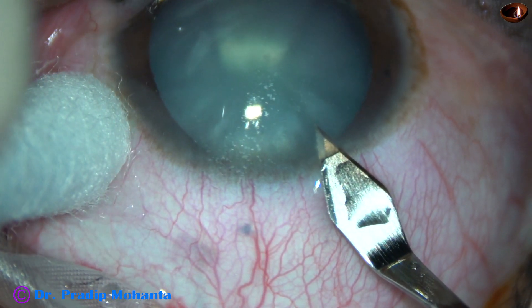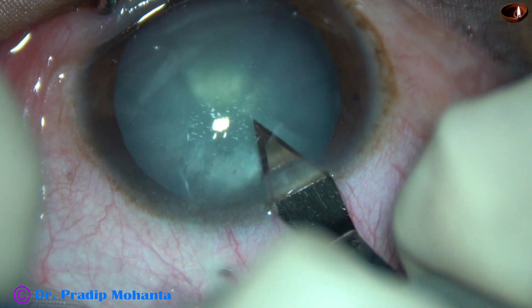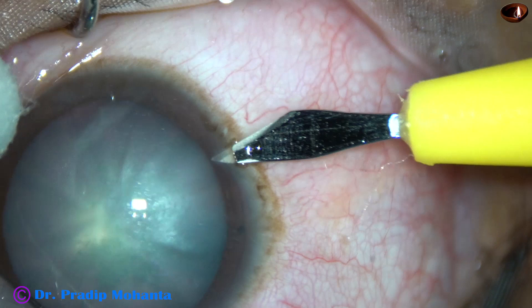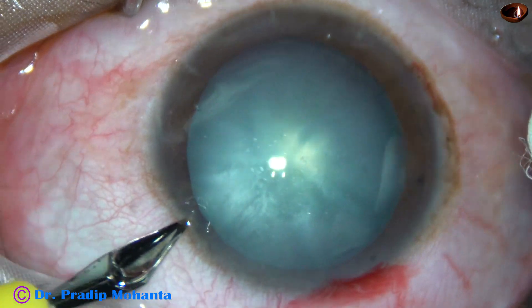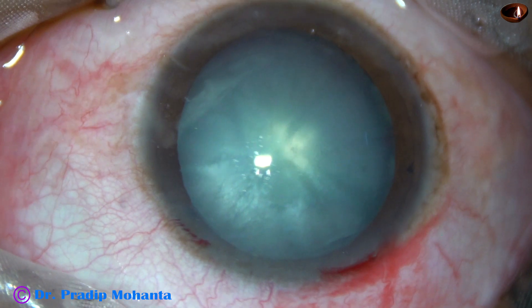This is the main incision at the posterior aspect of the limbus at around 11 o'clock. This is a side port on the right side of the main incision, about 3 o'clock hours away. And this is another side port on the left side of the main incision, about 2 o'clock hours away.